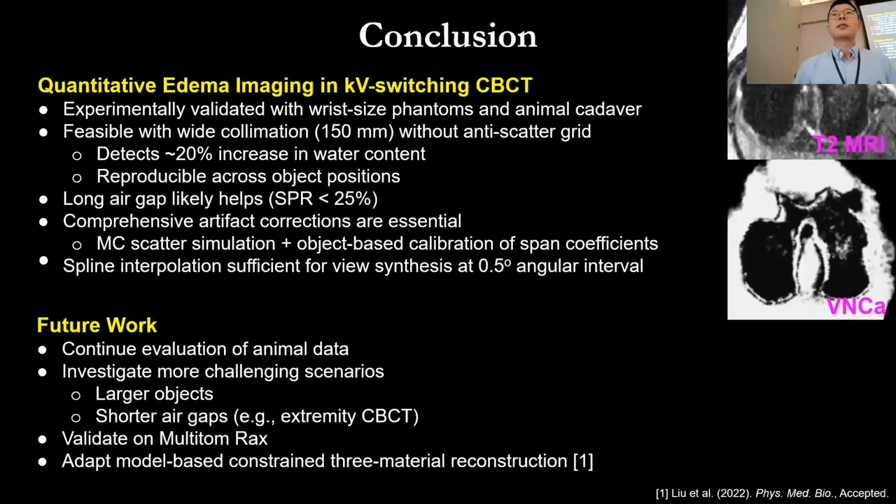Thank you very much. Those are very impressive results. I'm curious if you would try to stress test this decomposition algorithm to find one case where it's really difficult, presumably because the volume preservation constraint does not hold anymore. Do you have a feeling for what that case would be? Something where you have maybe water, fat, and calcium, but not in a compressible mixture?